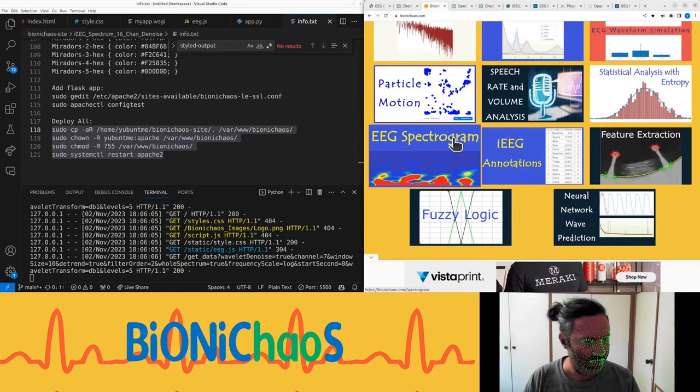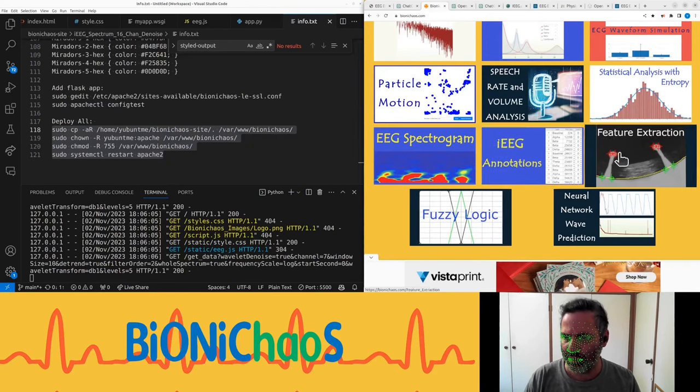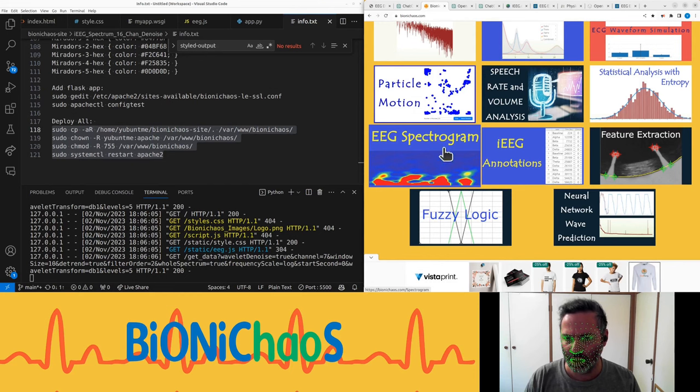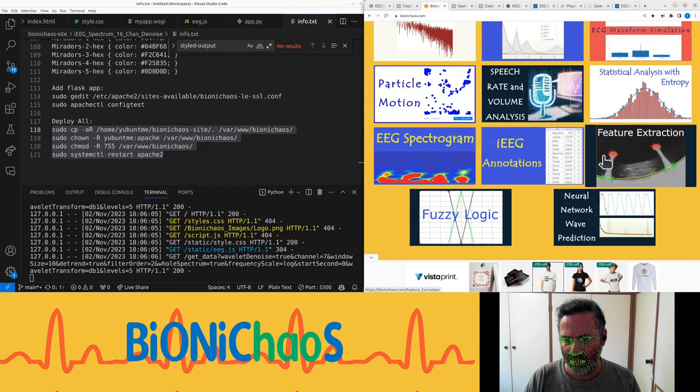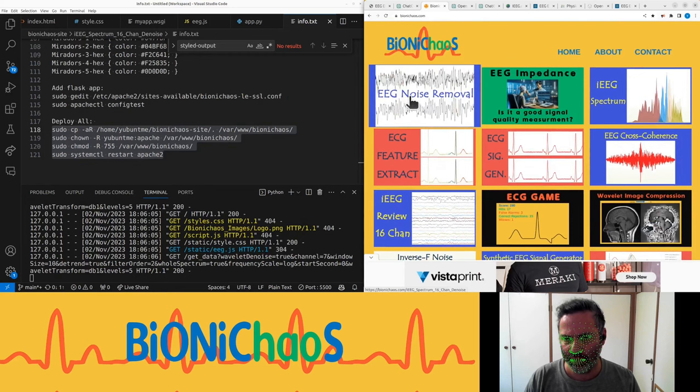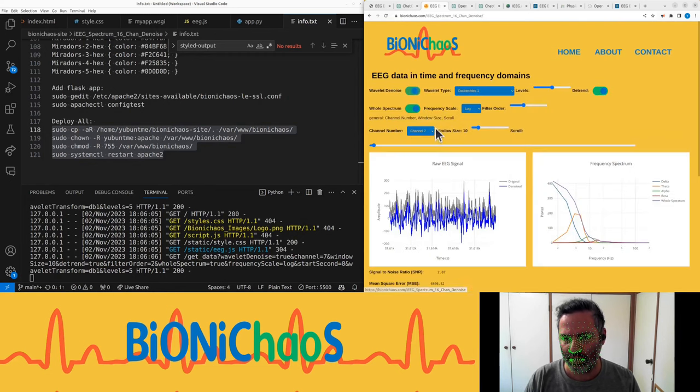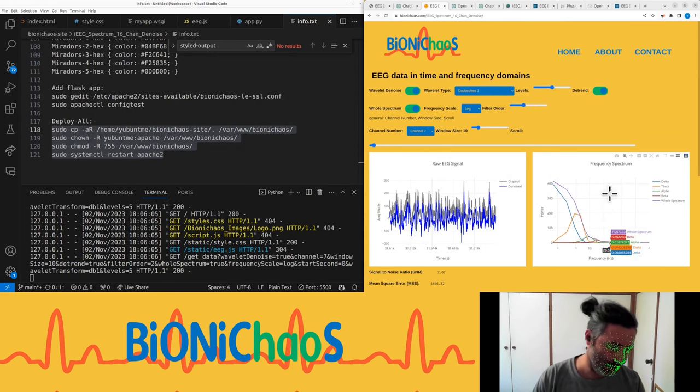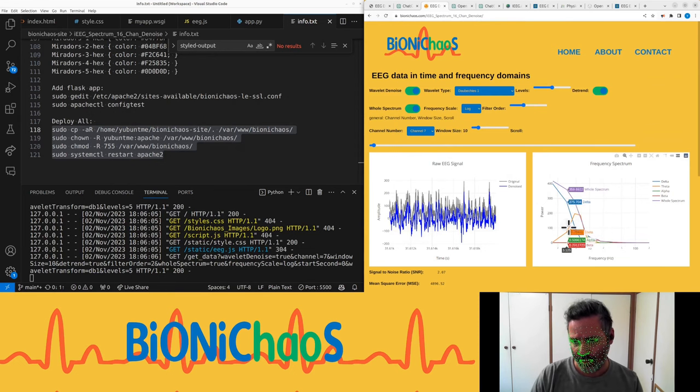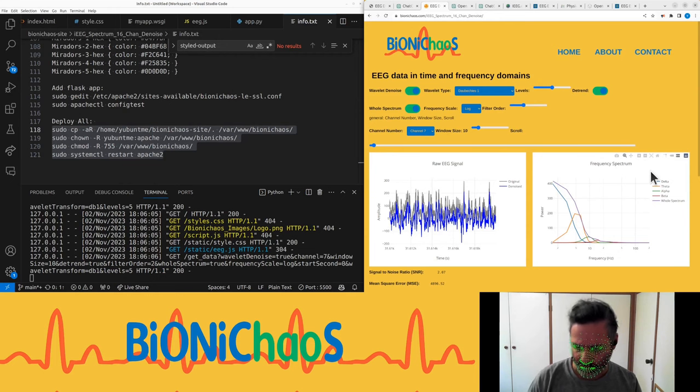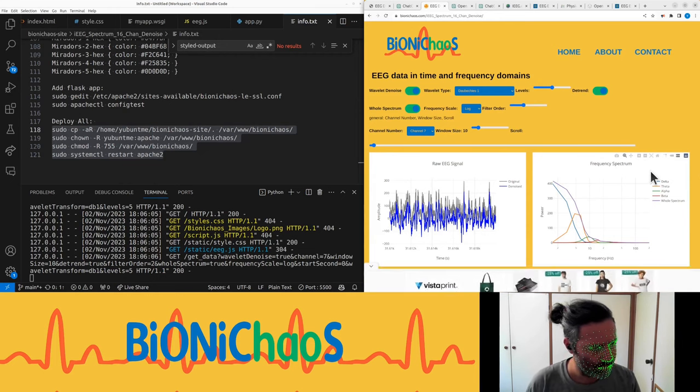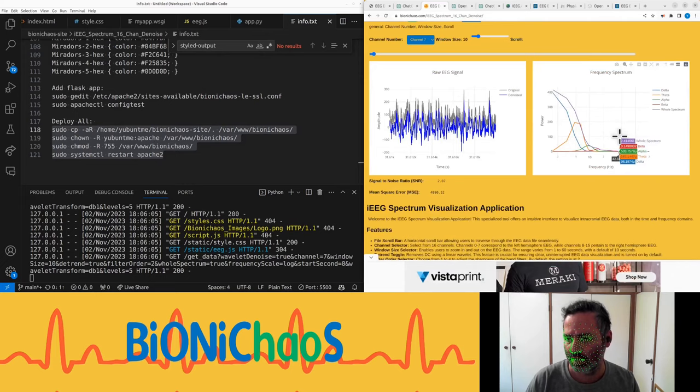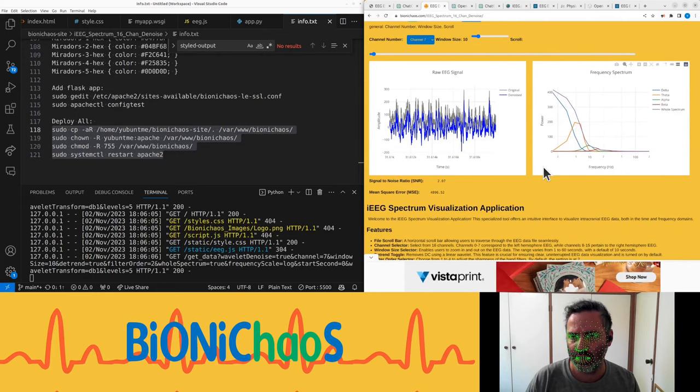Next time we'll be touching on those EEG spectrograms. Because currently this is frequency spectrum not the spectrogram. Spectrogram will be different. We'll touch on it, we'll do this probably next week.